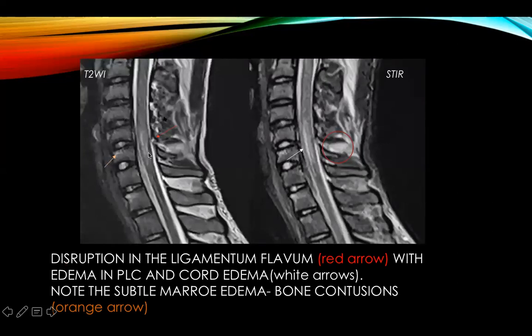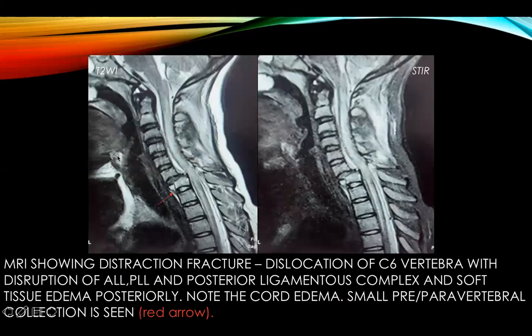In this case the vertebral bodies look normal with no evidence of obvious fractures. However, on close observation there is a breach in the continuity of the ligamentum flavum posteriorly, as depicted by the red arrow, and edema in the posterior ligamentous complex. Hyperintensity within the cord is suggestive of cord edema, and subtle hyperintensities in the vertebral body, depicted by the orange arrow, are suggestive of bony contusion.